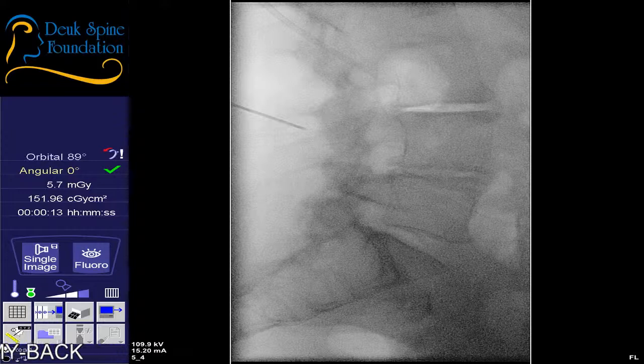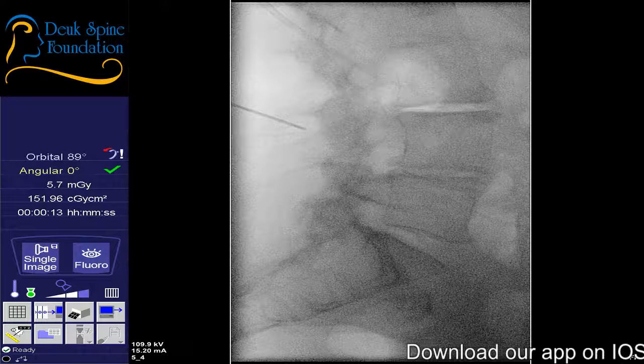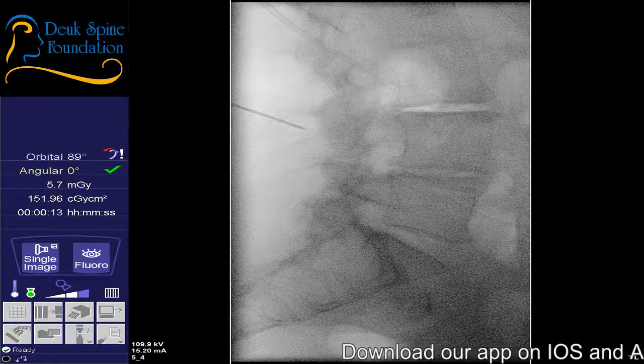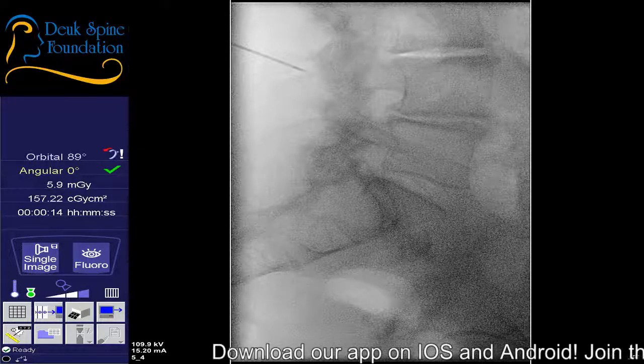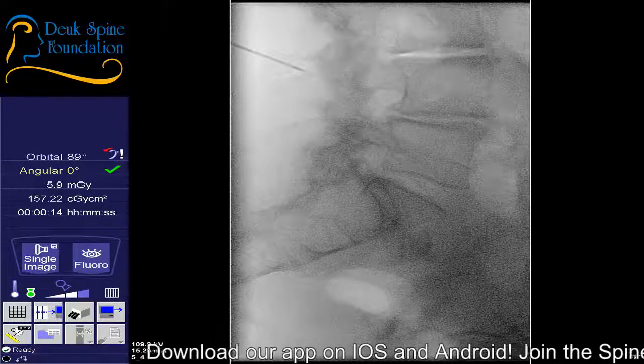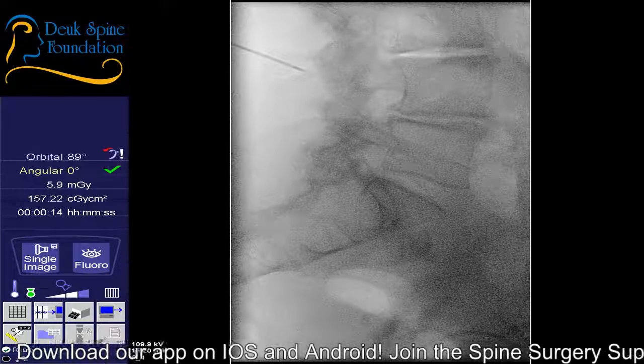I don't know, it doesn't look right to me. Let's see what we can do. Wag it some more. Yeah, a little bit of that, but I don't think that's the biggest problem. I think it's more wag still. That's really good. The pedicle's lined up nicely. I think that's probably as good as we're going to get.